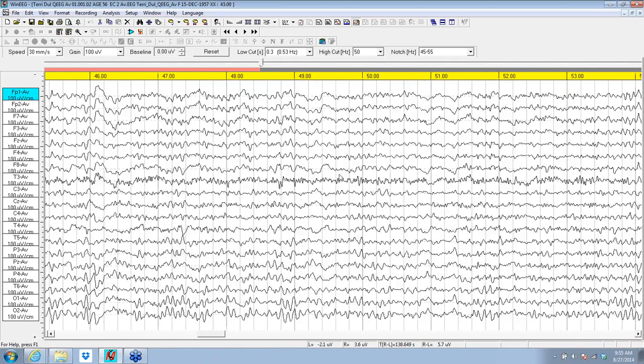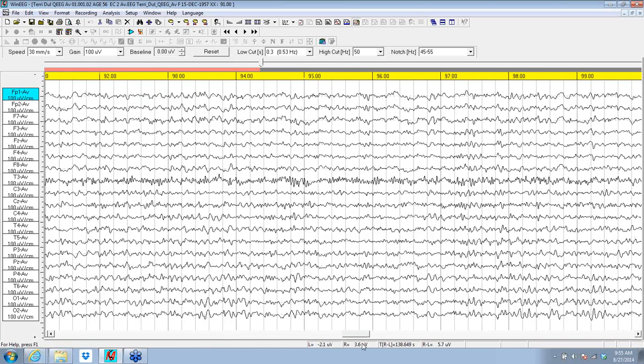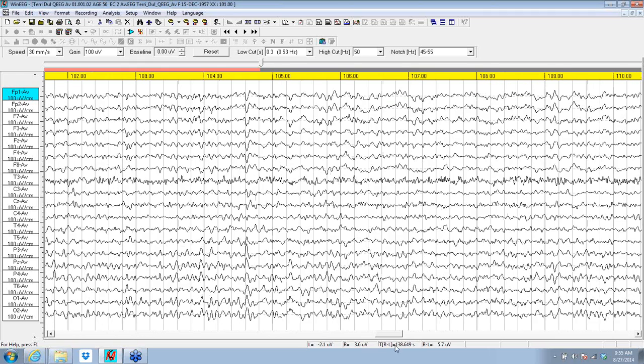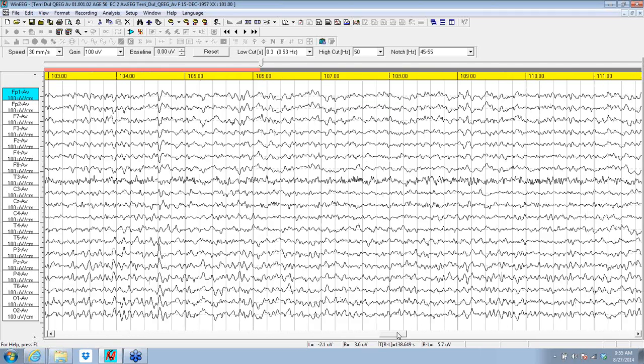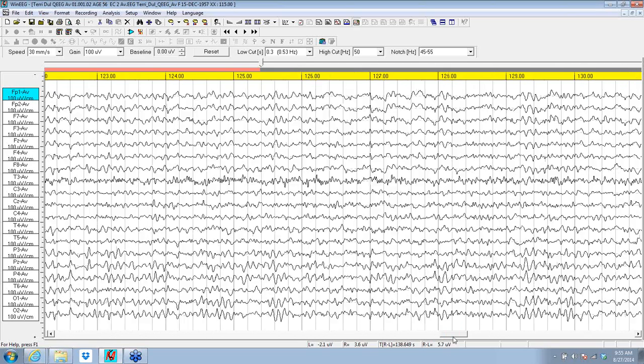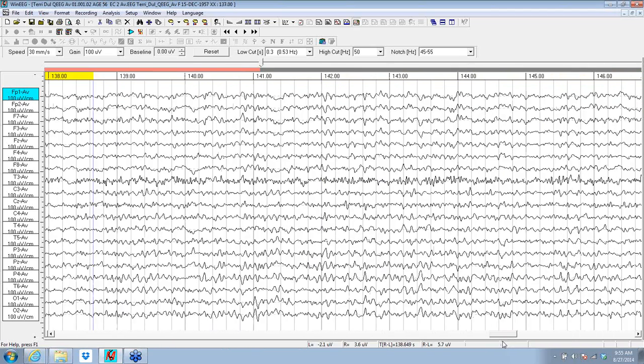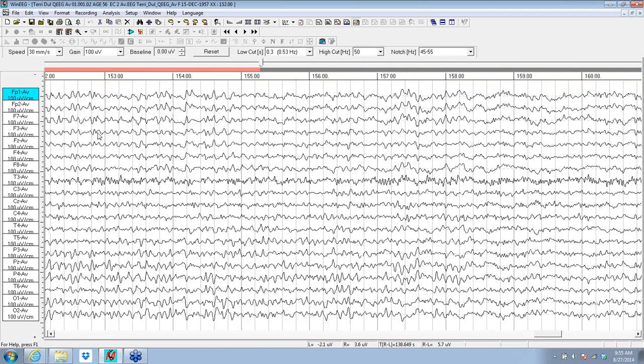we can see that we still end up with temporal slower transients, which may end up being vascular. And we'll take a look at that. We may have some minor vascular change here. And even though the alpha is really quite fast, a lot of it up front lines up quite often. We'll have to take a look at that. It's not the worst I've seen. It's probably just a touch over the expected norm level, but it's a bit increased in coherence.